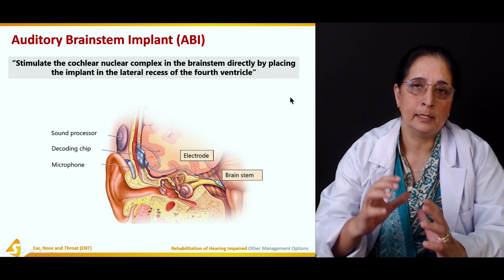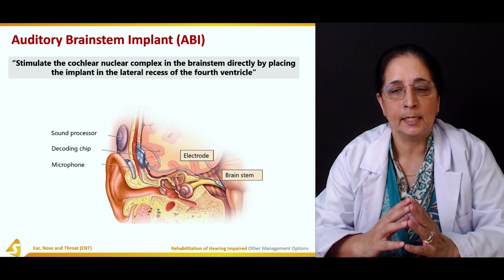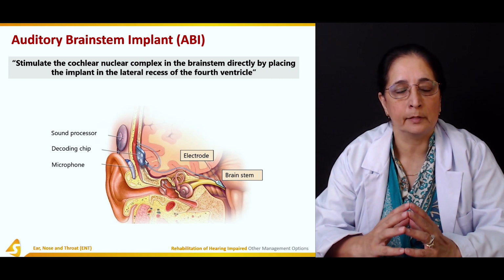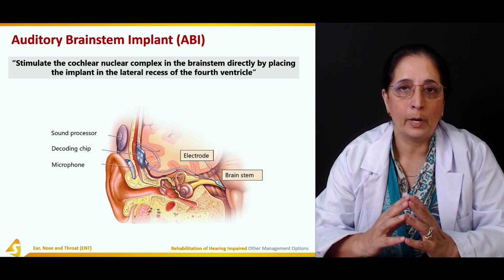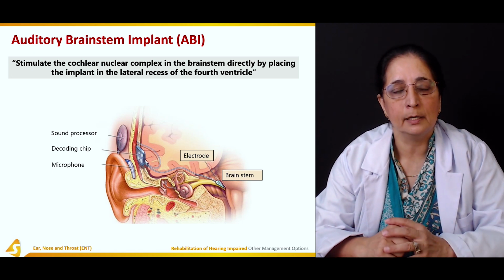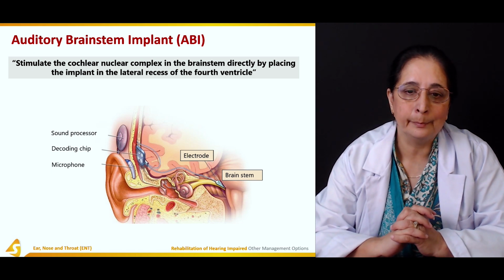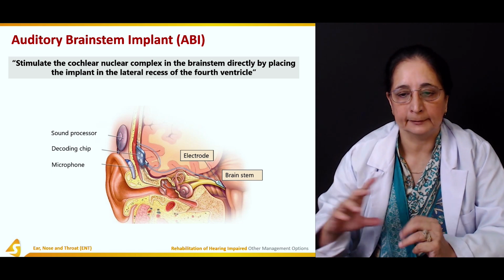So it's called the auditory brainstem implant.